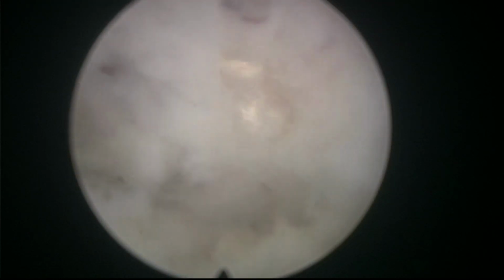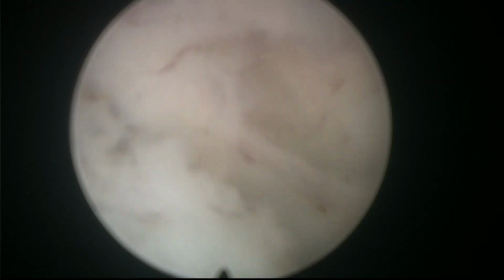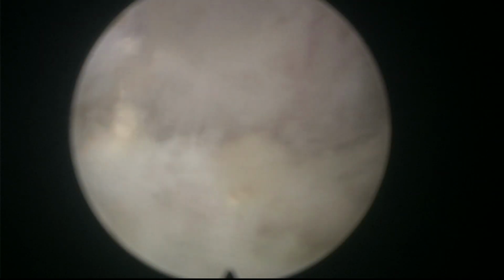So here we are coming up, all the way. And it's looking good. Again, you see going around the adenoma, following the circumferential line of dissection. Here, of course, you have to keep in mind that the adenoma is spherical or pseudo-spherical, but here we can tell for sure that this is the entry into the bladder at 12 o'clock. We are above the anterior commissure.